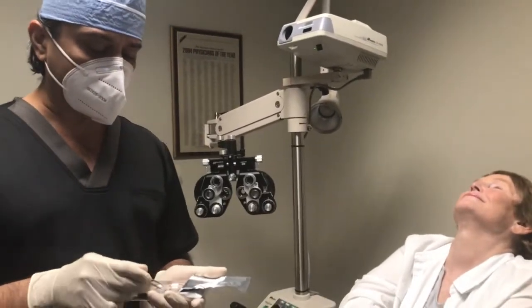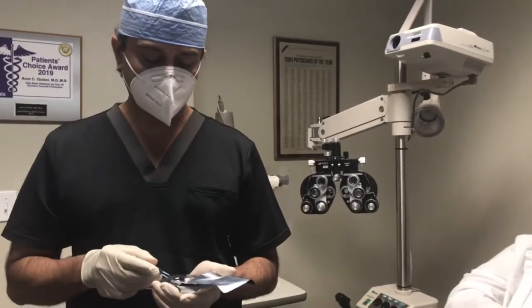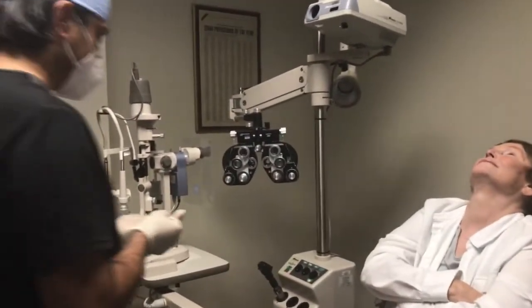You tell the patient they might feel a little uncomfortable because it's a large ring, but most usually it very nicely adjusts if you follow the technique I'll be showing you. I like the patients to keep this on for at least five days for an impact on the healing.